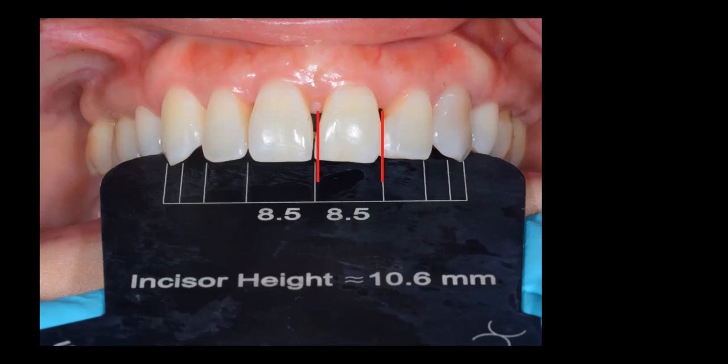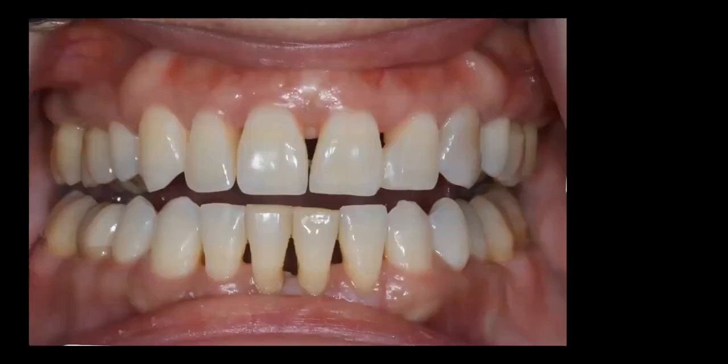In fact, in this case, we're going to be injection overmolding about 20 teeth because she wants all her black triangles to go away. So by the time you finish a case like this, that's what it's going to look like. So we're going to injection overmold about 20 teeth. And the charge for Bioclear should be very similar to what you would charge for a porcelain veneer.